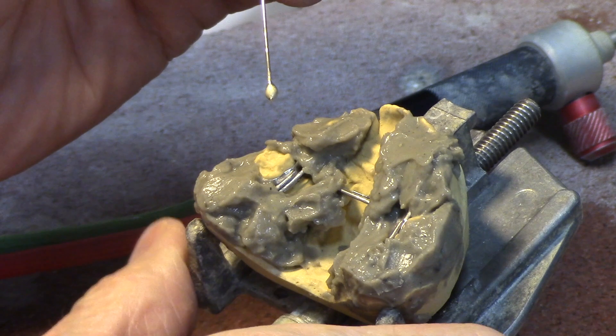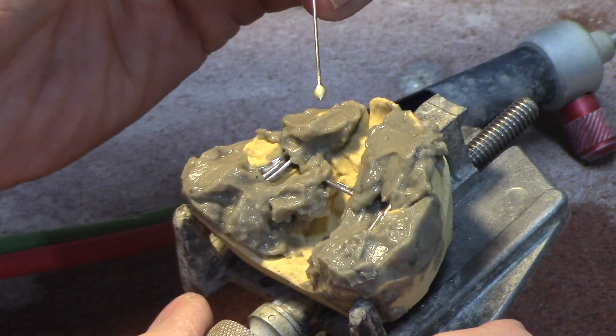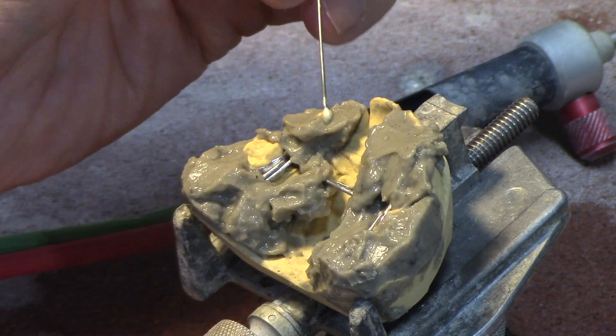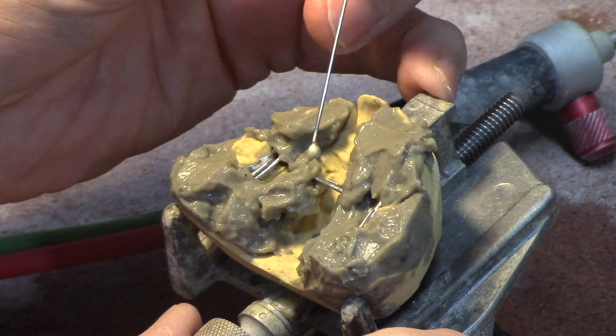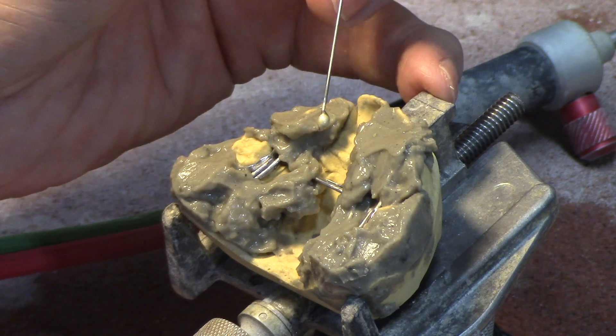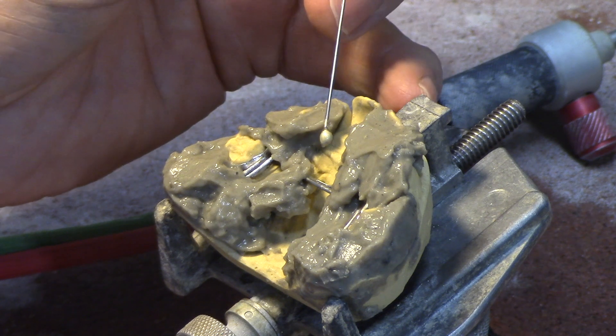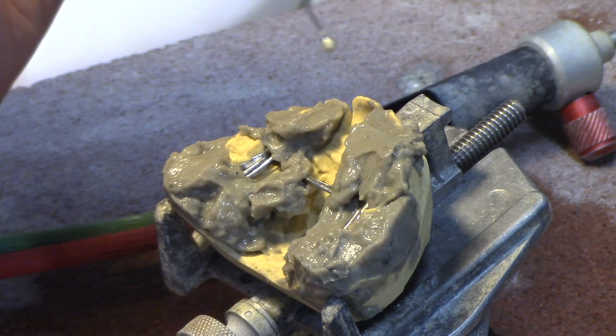Now this is that nickel solder — it's got nickel in it as well as silver. Please watch my silver soldering video part 1; I talk all about that. With the nickel you get not only the mechanical bond but you do get a chemical bond between it and the nickel chromium wires that we're going to be soldering here. You can buy that solder on our website ortholabvideos.com.